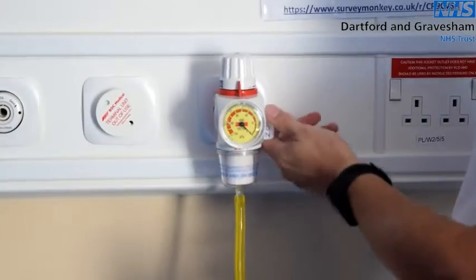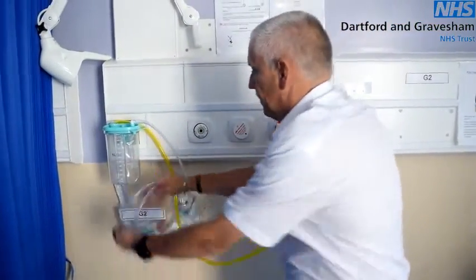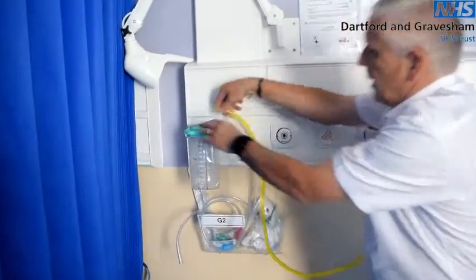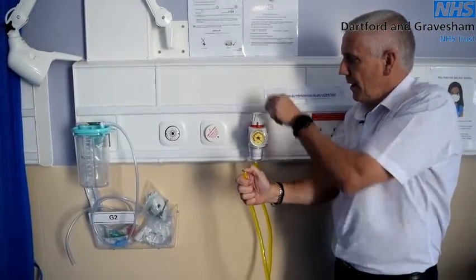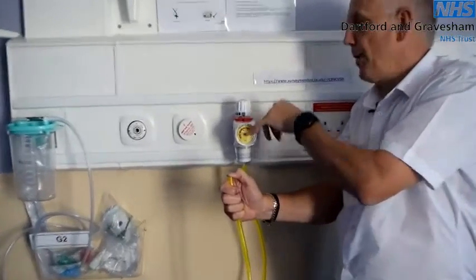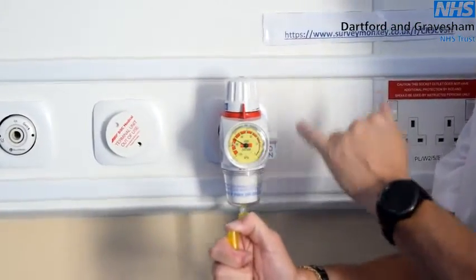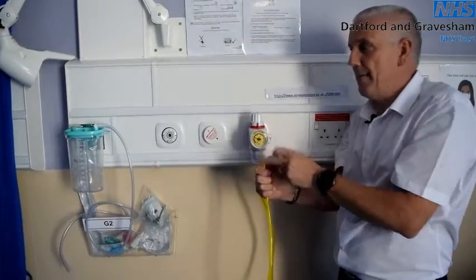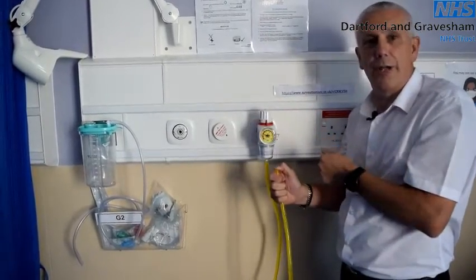If a leak is detected, the first thing you do is turn the tap off, go to the jar, and remove the yellow tubing. Put your thumb over the yellow tubing, turn the tap on, and increase the pressure again — it must be over 65 kPa — then turn it back down again. If the needle remains where it is, you have now proved there is no leak between the outlet on the wall and the input to the jar. Therefore, your leak is within the jar or the liner itself.